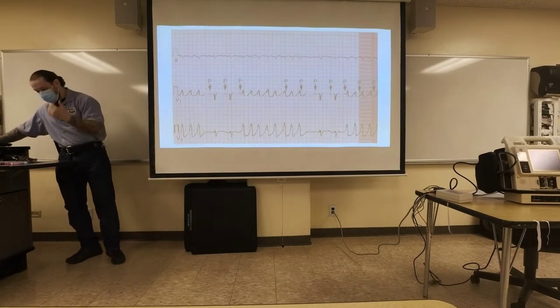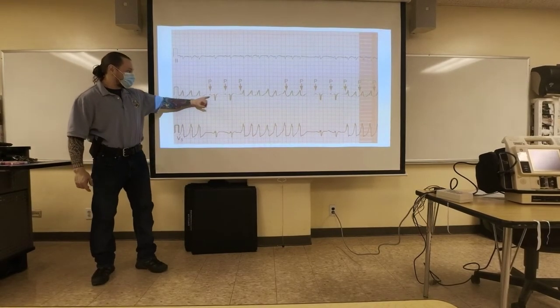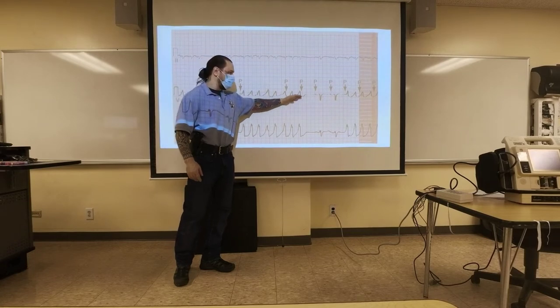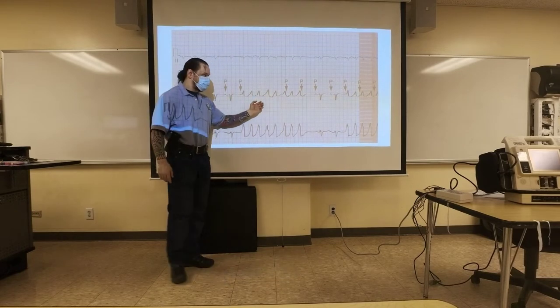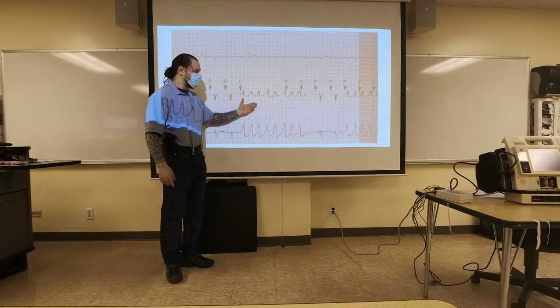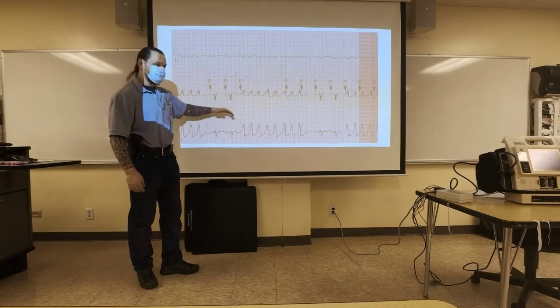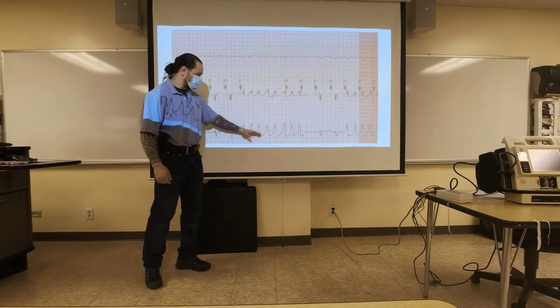This here is also a form of ventricular tachycardia, but it is not sustained. You see how the person was having a normal rhythm, and all of a sudden he has this burst of ventricular tachycardia, and then he automatically converts back, and then another burst. So this is still a form of ventricular tachycardia. We definitely want to address and treat it in case this person converts to sustained ventricular tachycardia. Your monitors will definitely flag it and say V-tach if this were to occur. So definitely pay attention to this. This is not a normal condition.